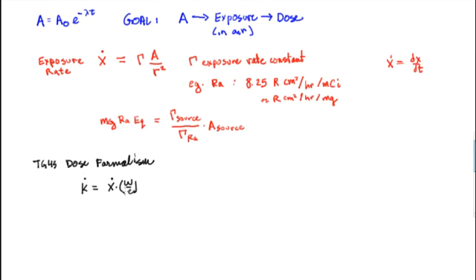Those are both rates. Okay, now in the TG43 formalism, we actually work with a related quantity called the air kerma strength. That's given a special symbol S, S_K, for the kerma. And this air kerma strength is equal to the kerma rate at some distance L, and you multiply by L squared because of the inverse square effect. So you can write this out then using the equation above: exposure rate times this W over E factor times the distance L squared.